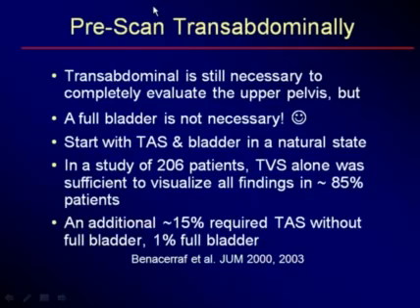Another way to avoid pitfalls is to pre-scan transabdominally. Now, transabdominal pelvic sonography in its pure form is no longer really practiced. What we're talking about here is still to take a look at the pelvis transabdominally, but not necessarily to have a full bladder. A full bladder is not necessary anymore.